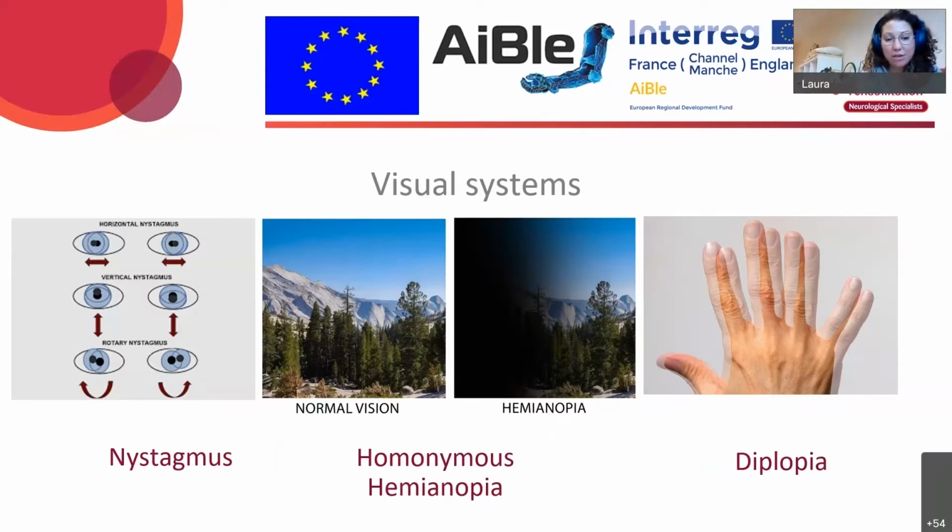Another aspect for consideration when thinking of asking our patients to interact with any object or piece of neurotechnology is vision. Our visual system plays an integral role in perceiving the world around us, including the objects that we want to interact with. Many stroke survivors will have a visual deficit of some form, which will reduce their ability to successfully see the world around them.